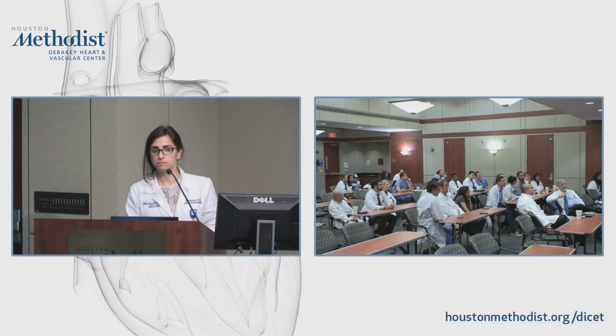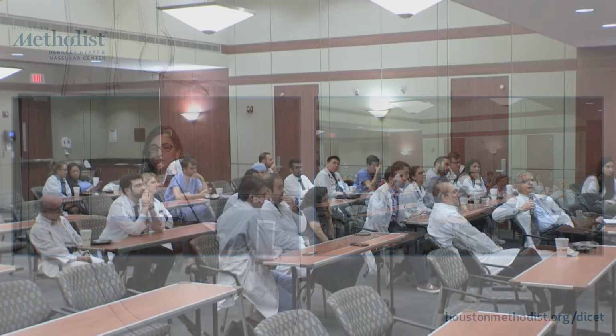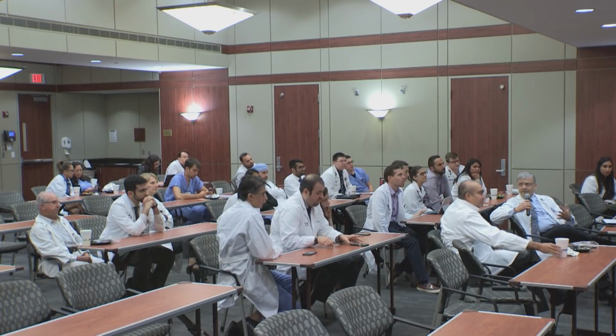Yep. And it looks like rheumatic etiology, or at least there's some doming on it. So if I need something, I need hemodynamics. And even then, I'm really not sure, because I'd like to know maybe the PCW on this individual, and is there some pulmonary venous hypertension because of the chronic situation? You have a low flow in the pulmonary circulation, so your PA pressure may not tell you about pulmonary vascular resistance, because this is a low output situation to the left side.